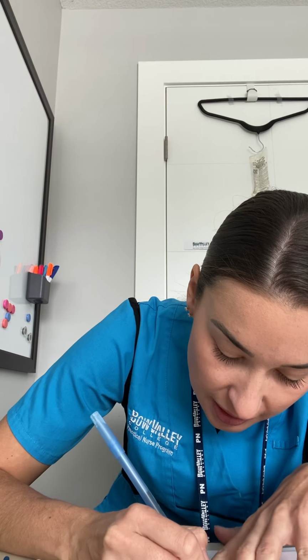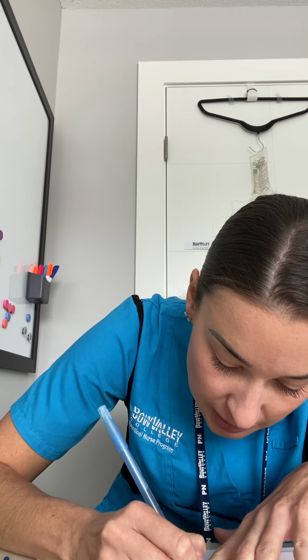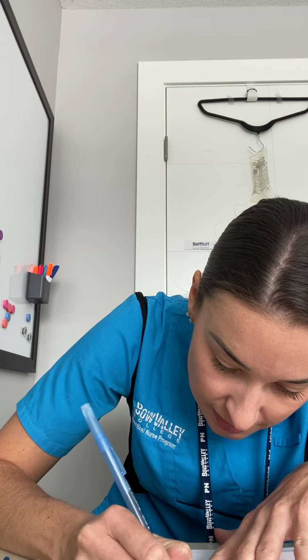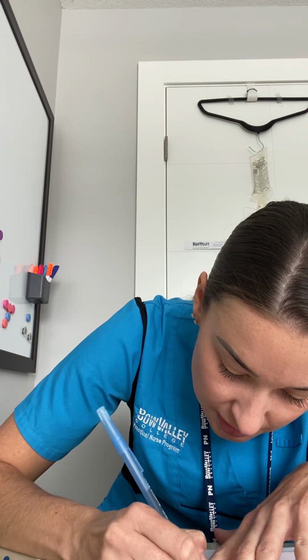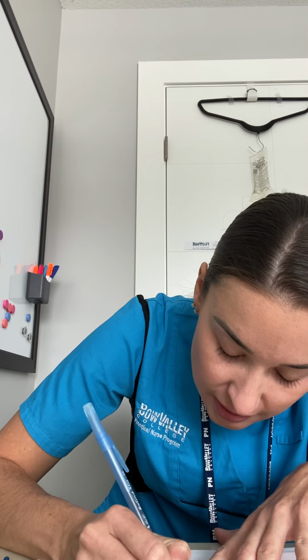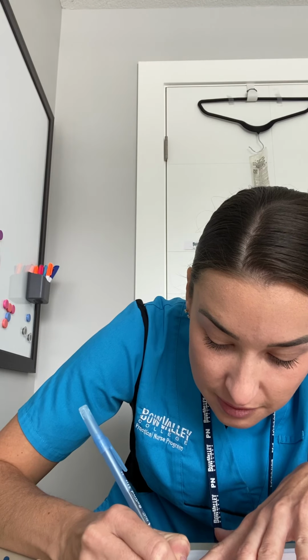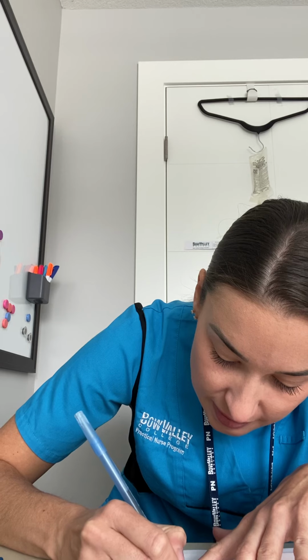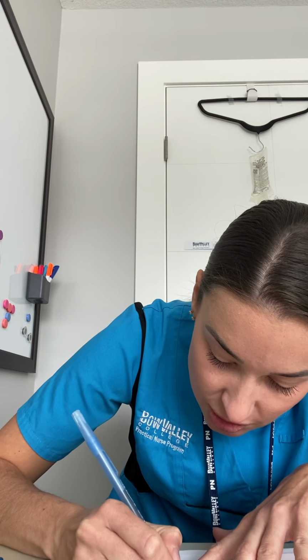We have 4 milligrams of dexamethasone at 1500 on October 26, 2020 for Allison Chinook.